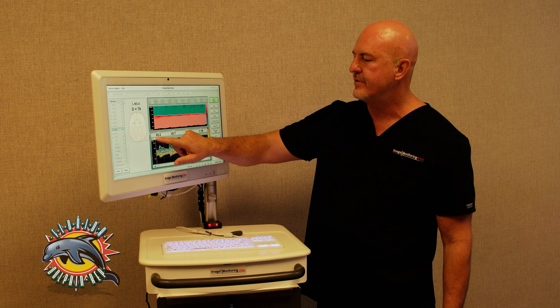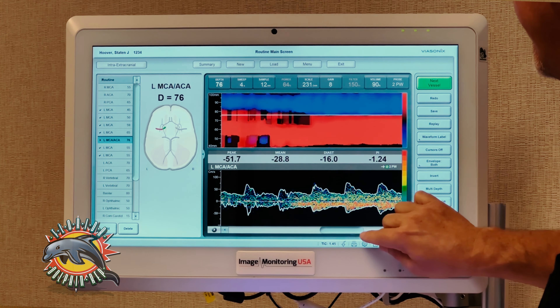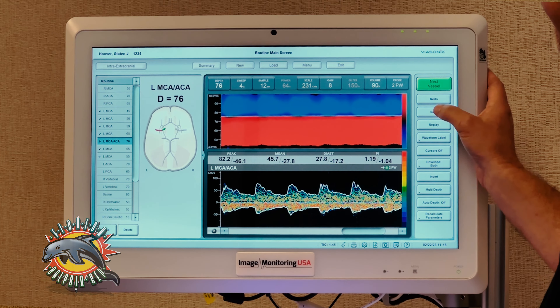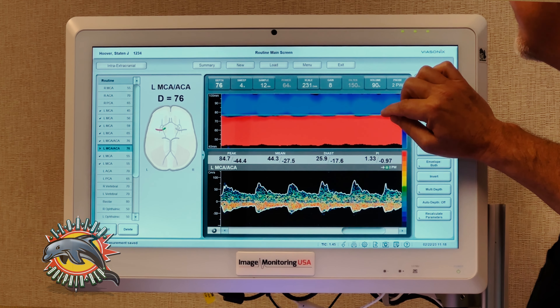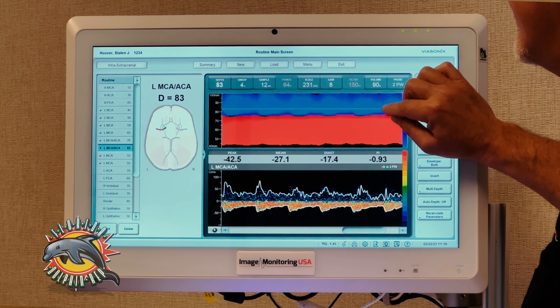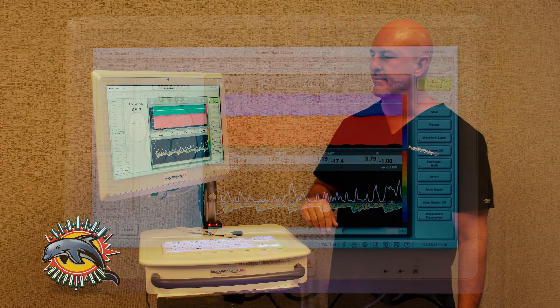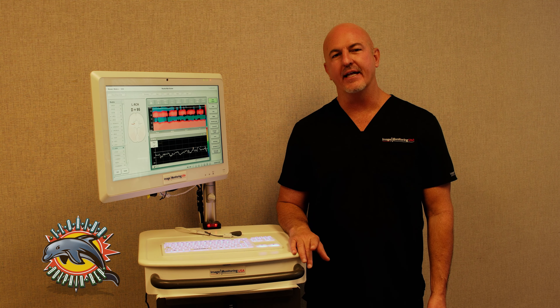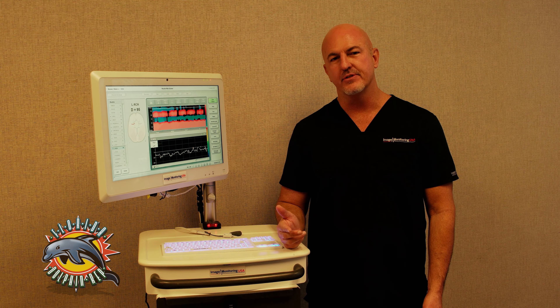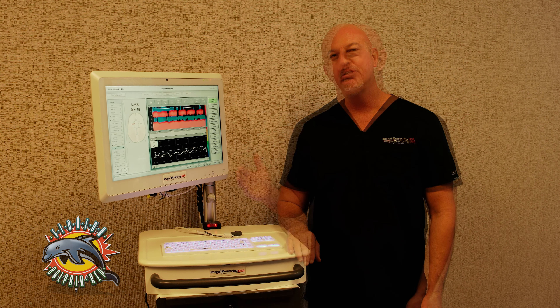Then I can continue up to my bifurcation and get my MCA-ACA, and all I have to do is simply change my label. Then I change my envelope and save that. So now I can walk this up into my ACA and save whatever depth I want, as many times as I need to, just like I demonstrated with the MCA. From one scan, I was able to capture several depths within that same vessel, and also capture other vessels, rename them, and change the envelopes.